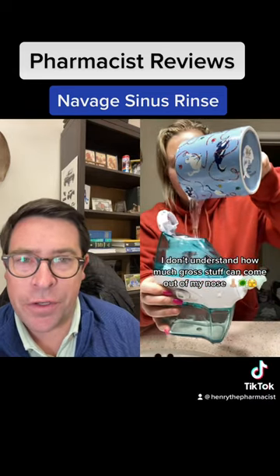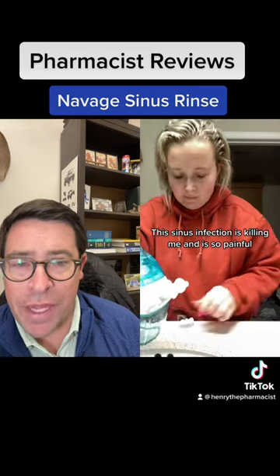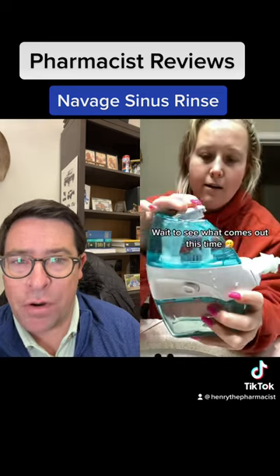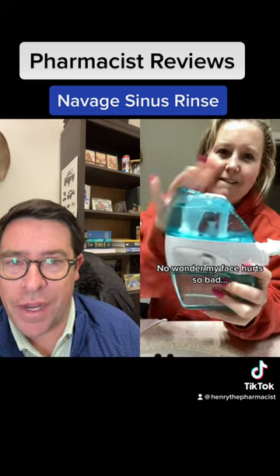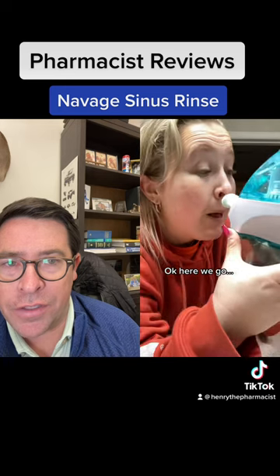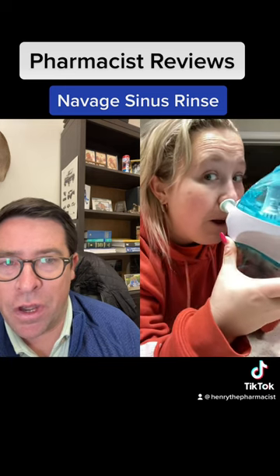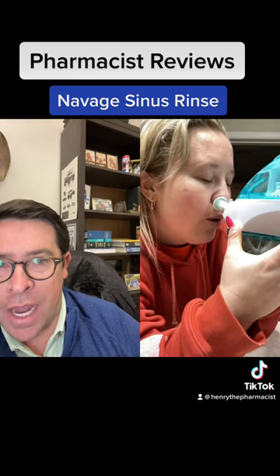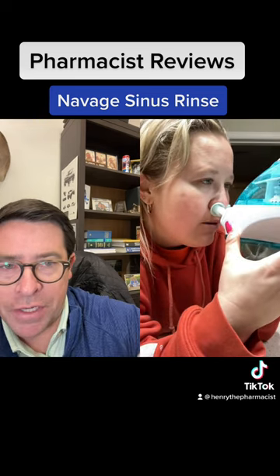This is a Navage device. She's filling it up with water — hopefully that's either distilled water or boiled tap water. You should not use plain tap water in these devices or any other nasal rinse devices, with all the impurities that are out there. This device is battery powered, so it'll actually pump water into one nostril and out the other, falling into the bottom container.